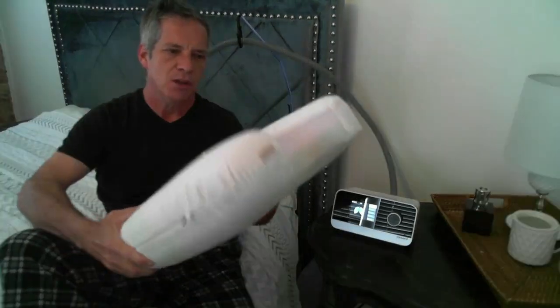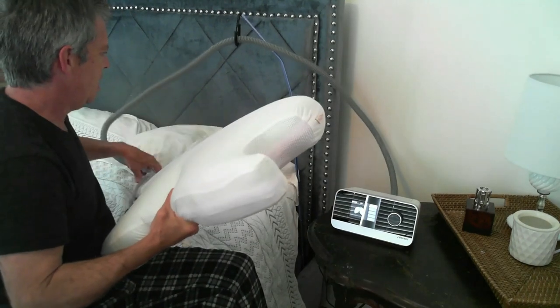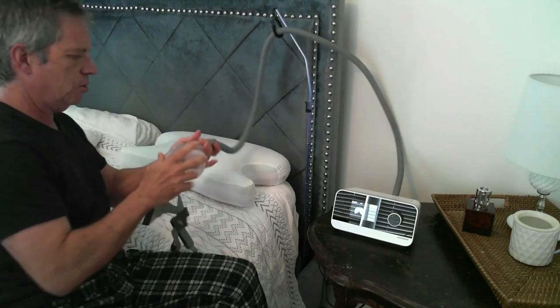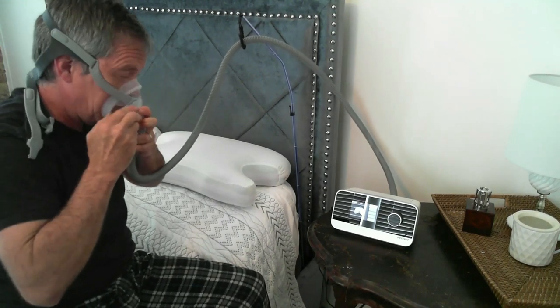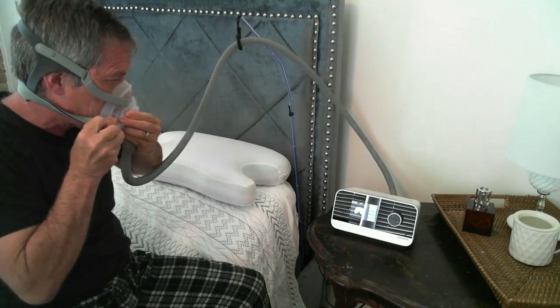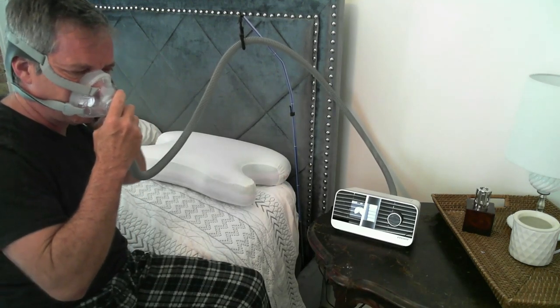I want to show you the CPAP pillow. With these cutouts right here, it gives you a place where whenever you're sleeping with your mask on — let me put the mask back on to demonstrate.